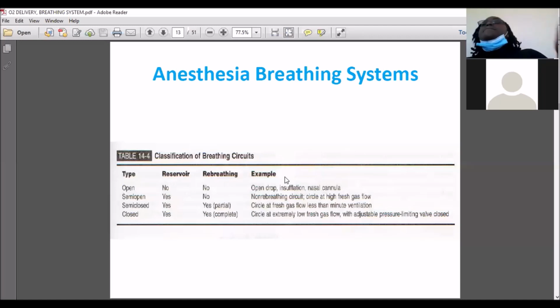The air you're breathing is the same cycle over and over again, but in the polythene bag the partial pressure of carbon dioxide will increase because there is no filtering, which will cause you to suffocate. Here the filtering helps purify your air, to have a higher concentration of oxygen than carbon dioxide. It's understood.